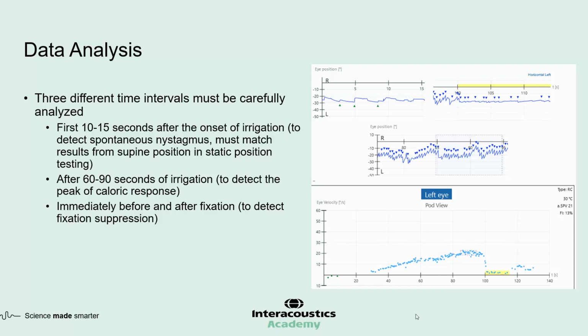They all have a very similar pattern. They start at the baseline. If the person is normal, has no spontaneous nystagmus, that baseline is about 0 degrees per second. Then from there, the nystagmus intensity rises.